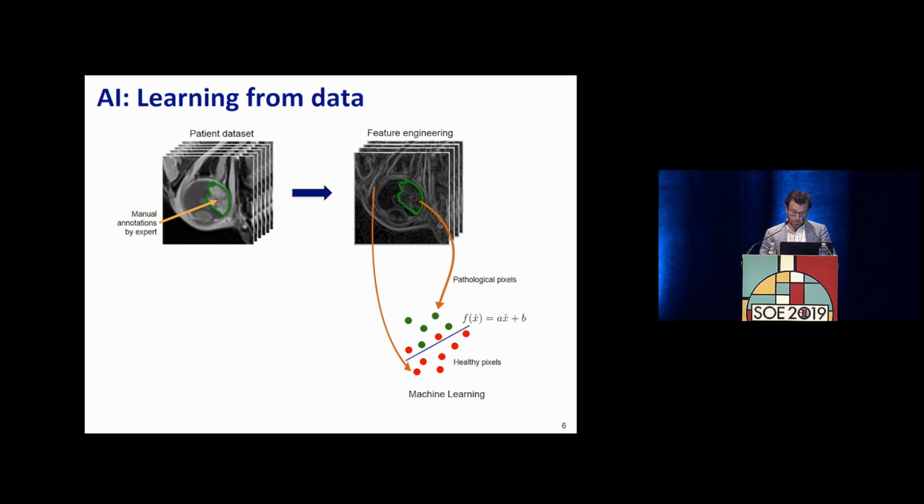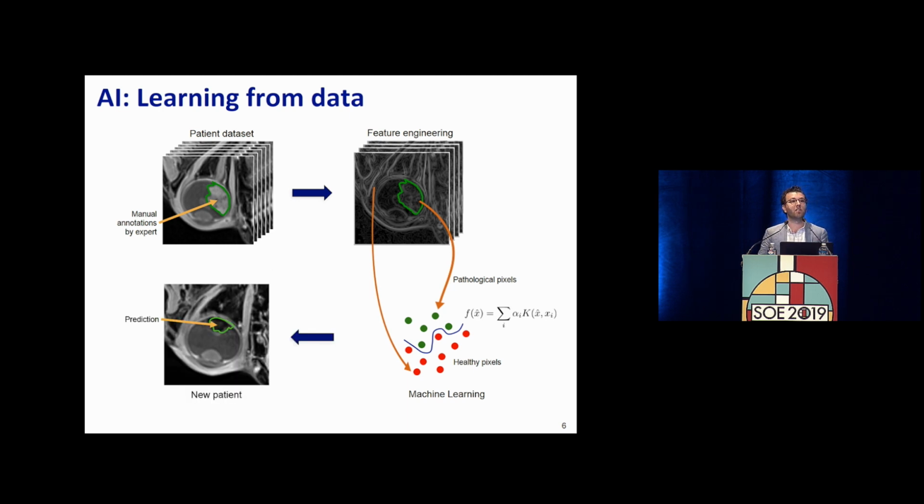Right? So what machine learning really talks about is complexifying this line into more complex models, where instead of having just 2 parameters, you maybe have 1,000 of them, or 2,000, 10,000 parameters. There, doing it by hand is not reasonable, and that's why you need computers to solve the parameters of this model. Because once you have it, you can actually use it to do prediction forward.